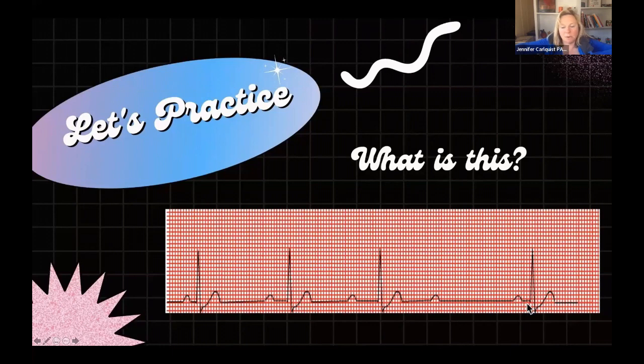But as in most soap operas, you know where that goes, right? Things start to decline in the relationship and then there we are again. We rinse and repeat the whole thing. Okay, and eventually that proceeds into a higher degree block, most likely. However, interesting note, I have seen young athletes and people with sleep apnea on their Holter monitors sometimes have Wenckebach.